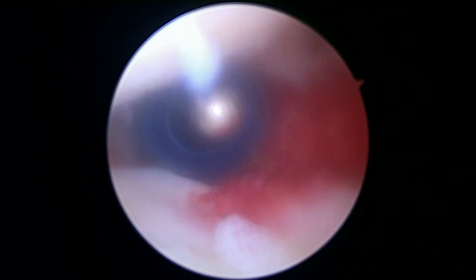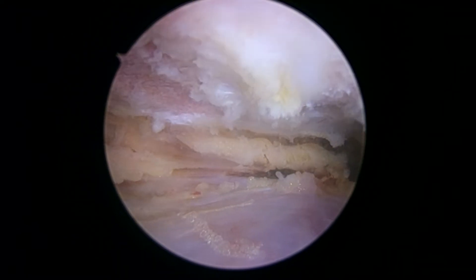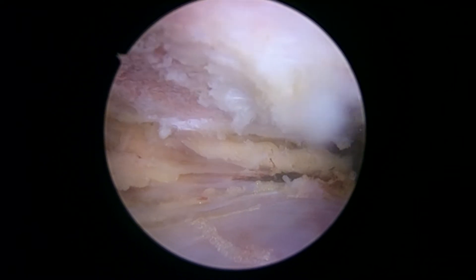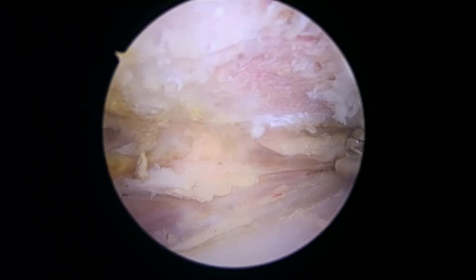Probably the next thing we'll show you will be our work in the subacromial space. So we're in the subacromial space, we're just finishing up with our decompression. Let me get the burr on there. That's the front edge of the acromion there. Your rotator cuff looks great on this side, so pretty comfortable that the rotator cuff is good.